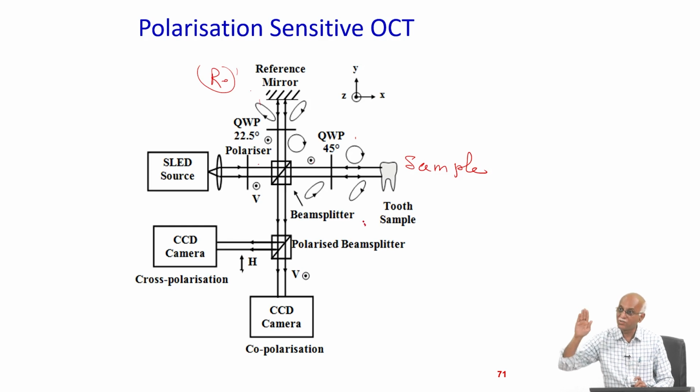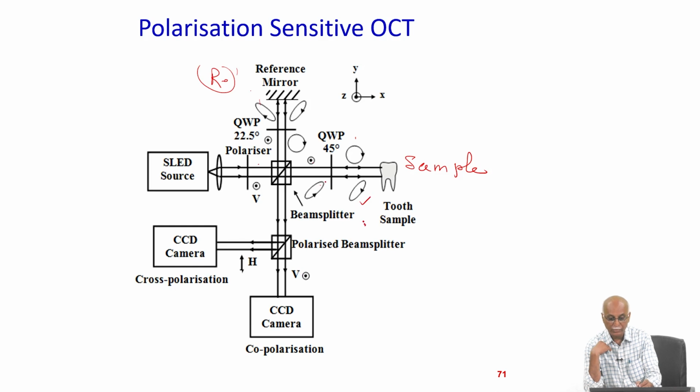So, the phase changes, and that results in an elliptically polarized light beam. And when it passes through this 45 degree plate, this wave will get converted into the opposite, as I explained in the previous slide, it will help you understand how that orientation will not move along the same direction, it will revert back.